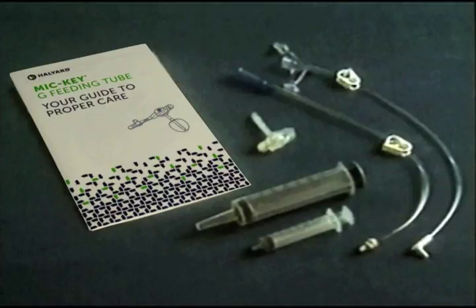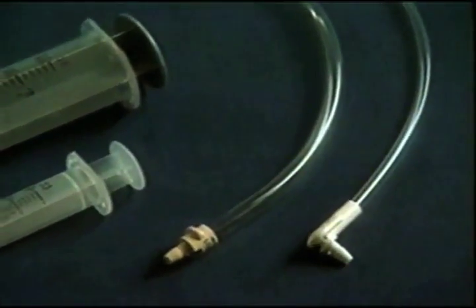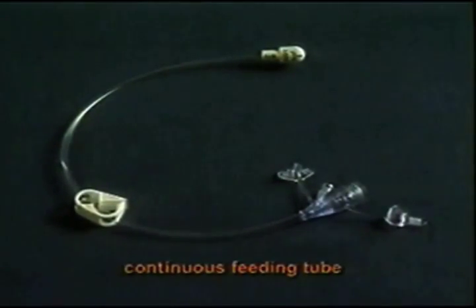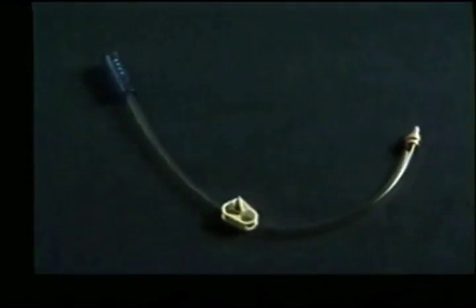The Mickey kit comes with several important accessories you'll need to get started with feedings right away. It includes 2 types of extension sets for 2 types of feeding methods. One for continuous feeding, where the feeding is administered with the use of a pump and over a longer period of time. The other for bolus feeding, where feedings are periodic and usually of short duration, like breakfast, lunch, or dinner. The doctor decides whether bolus or continuous feedings will suit the patient's nutritional needs better.